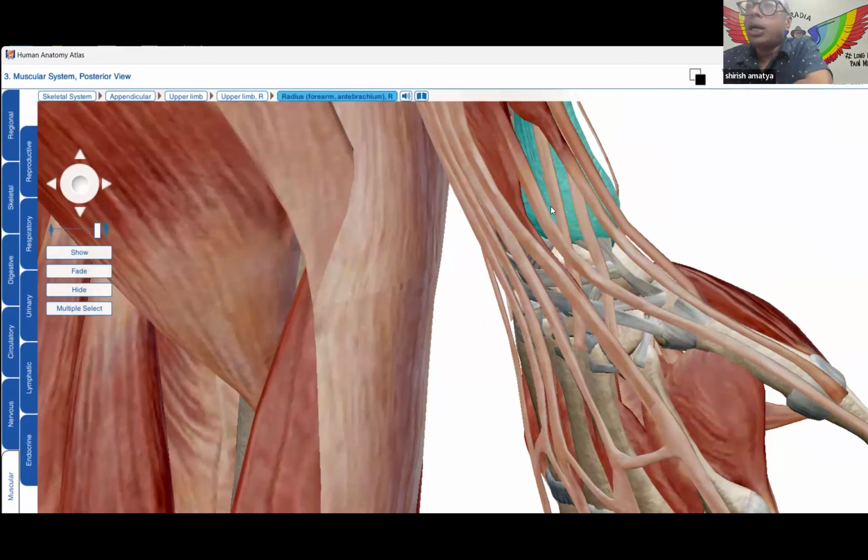It separates the second compartment from the third compartment. You will nicely see a mountain-like bony projection in ultrasound. This is one of the landmarks by which we know which one is the second compartment and which one is the third compartment.